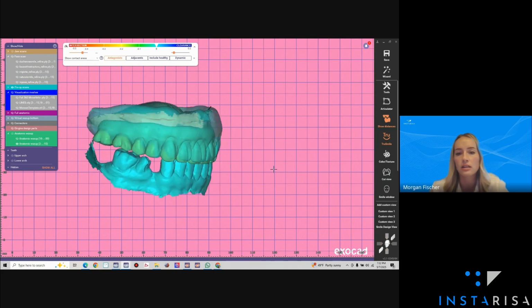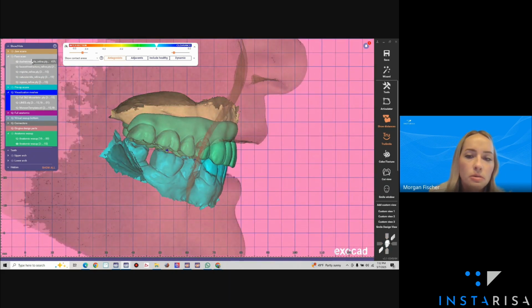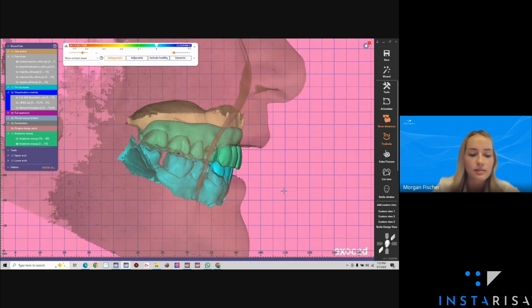So I'm just looking at the buccal proportion. We can turn on the patient smile, see where we're at here. This is great in the healed phase to make sure that lip proportions are good, and we don't need to be pushing anything out or pulling anything in. On the day of surgery, of course, a lot of things are moving and changing. So it's a really great guesstimate at this point.